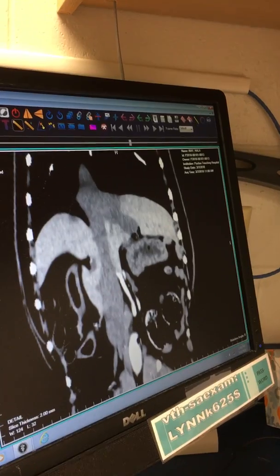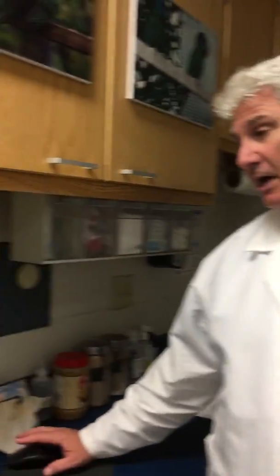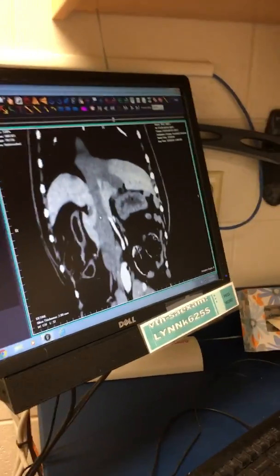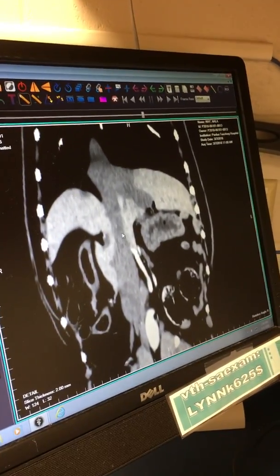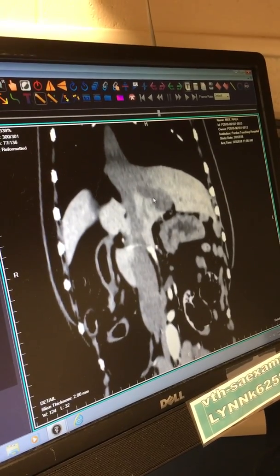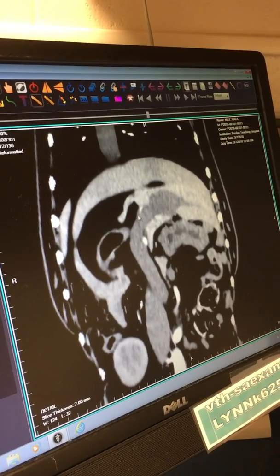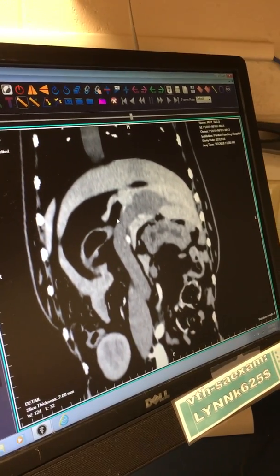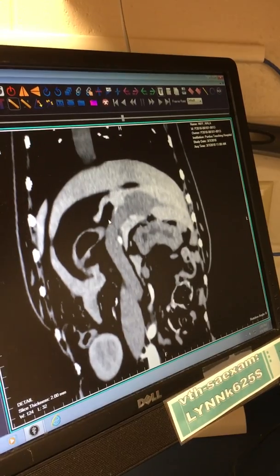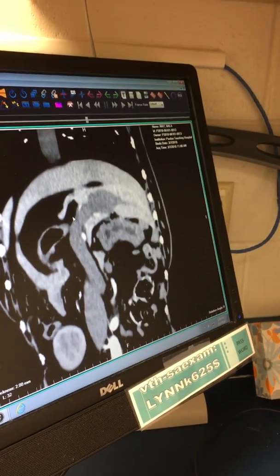I did a procedure like this on a tiger out in Kansas, and that shunt vessel had no narrowing, and we did a bunch of different stuff with that. But we don't have all those options here. The other possibility, though I don't think we could do this, is we could gain access here and work our way down all the way to here, and try to put a plug in there. But I don't think we'll be able to make that turn. I think it's going to be too tight. I mean, it looks easy enough, but you've got these tight turns and everything. I don't think we'll be able to do that.